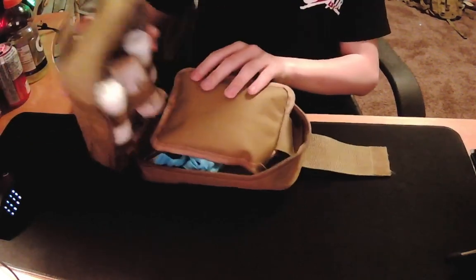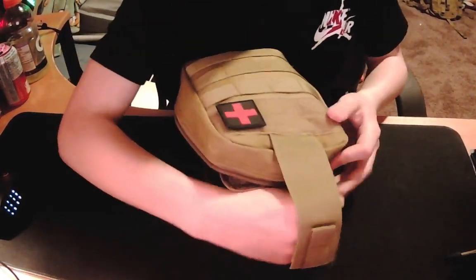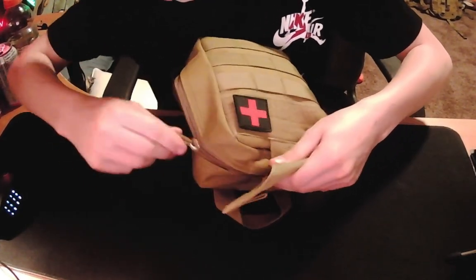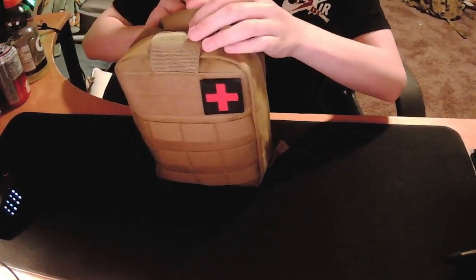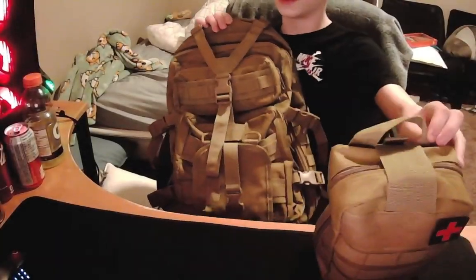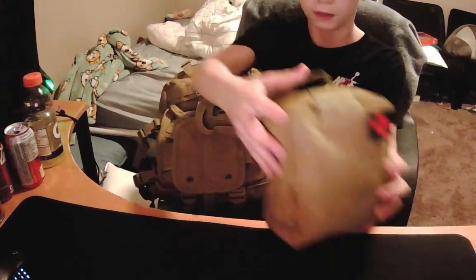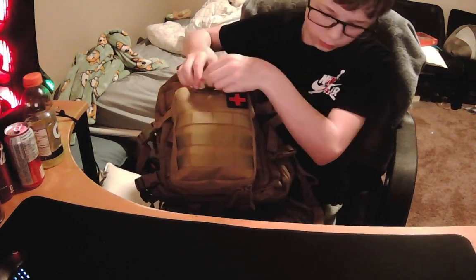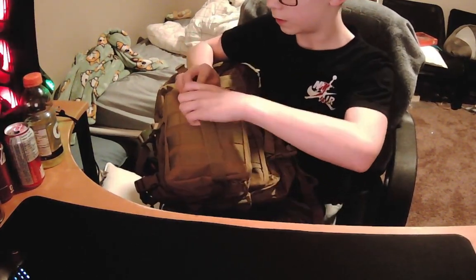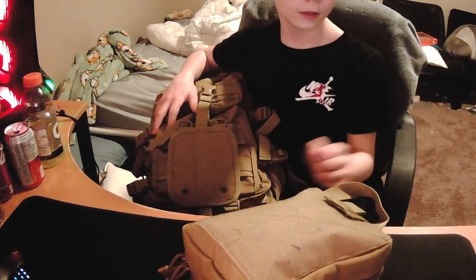And that is my first aid kit — a little bit difficult to close. There's my backpack, and here I have this little pad that's MOLLEd on to my backpack. I just take my med kit and curl it on, buckle it onto my bag. When I want to use it and I'm in a rush, I just undo the buckle and rip it off.